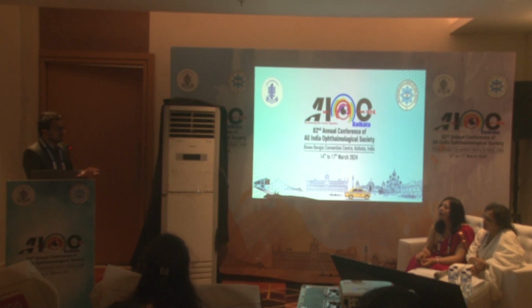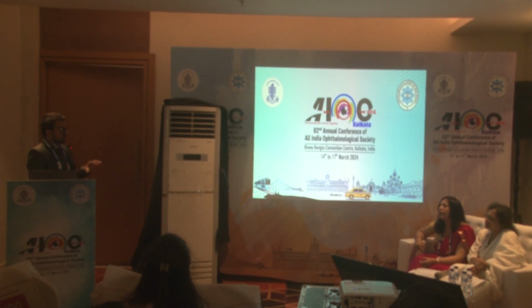Actually, I think that whenever you take the photograph, you should write everything, like the patient details, or if you are using the EMR, you can add the EMR number in that photograph itself, or there are notes that you can add in the photograph that can help you later in publishing that part.